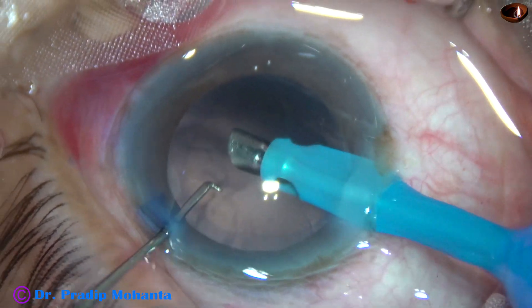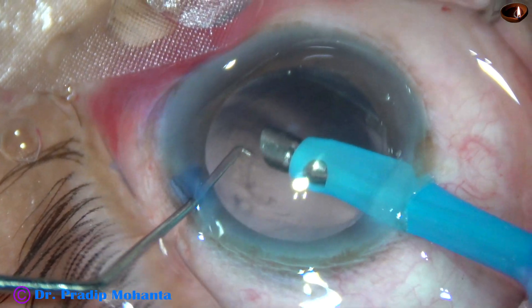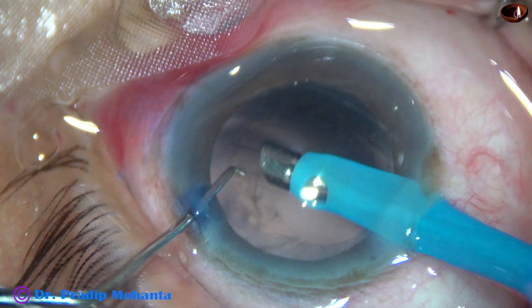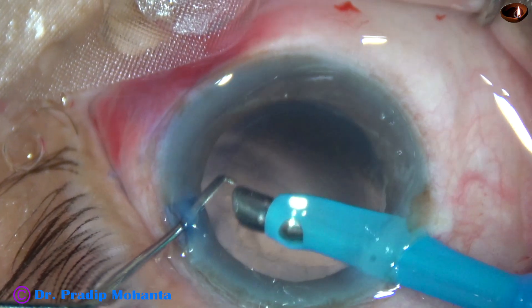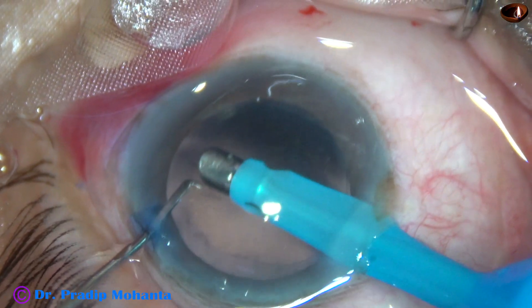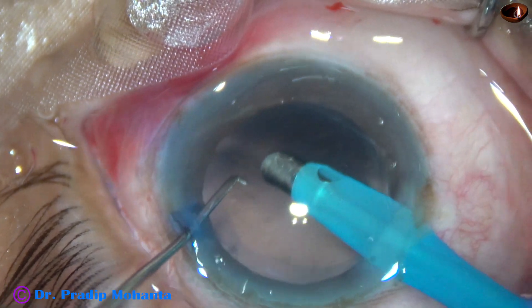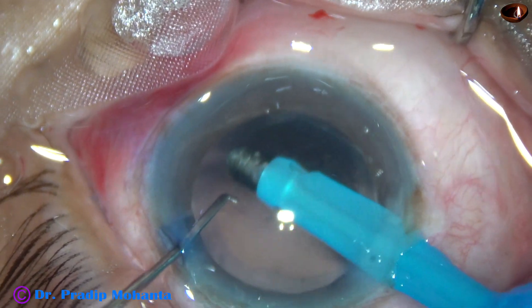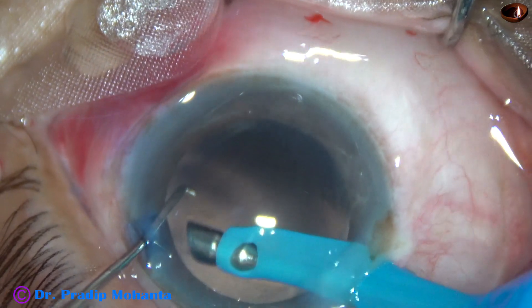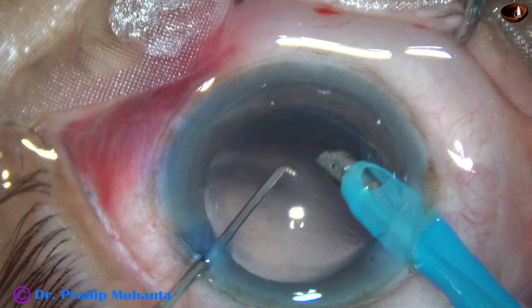Cortical cleanup has been done and now capsular polishing. Vacuum is only 10 and flow rate is 15 at this moment. I am attempting polishing of the posterior capsule, very gently, very slowly. And it is, to my surprise, being done quite safely. Yes, capsular polishing is done nicely.